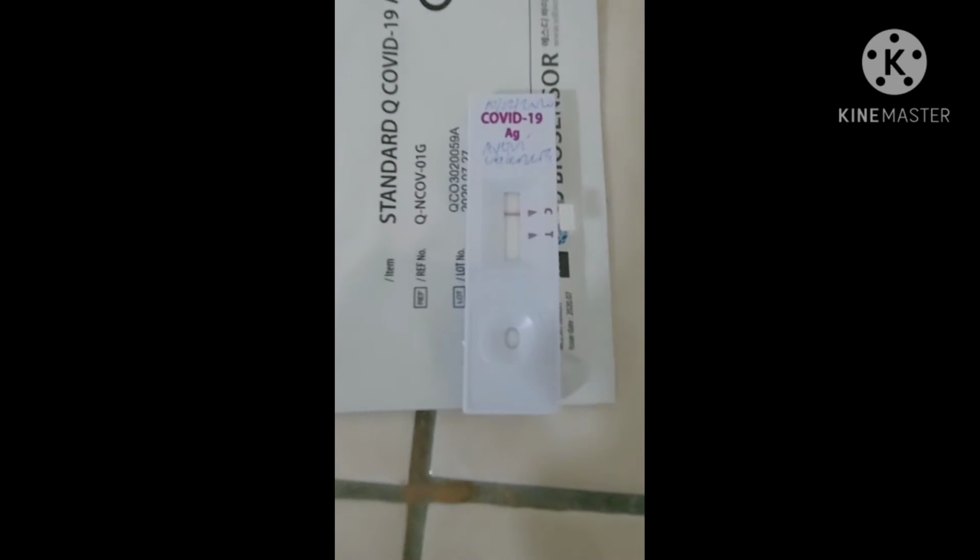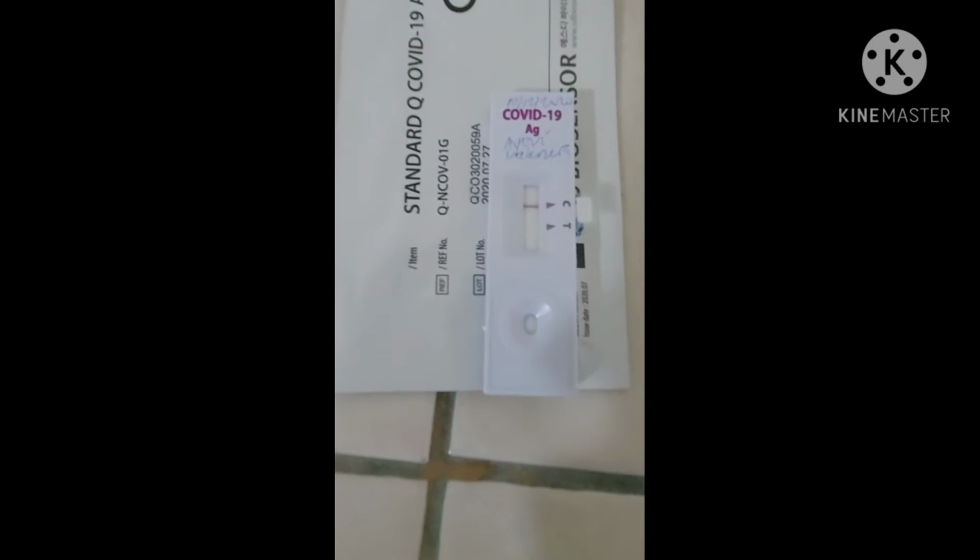Okay guys, now let's talk about the interpretation of this result for the antigen testing. Well, here is the test we did a while ago in this video. If you can see clearly, the date is written, the name of the patient is written. It's very important so that you don't mix up the test kits.